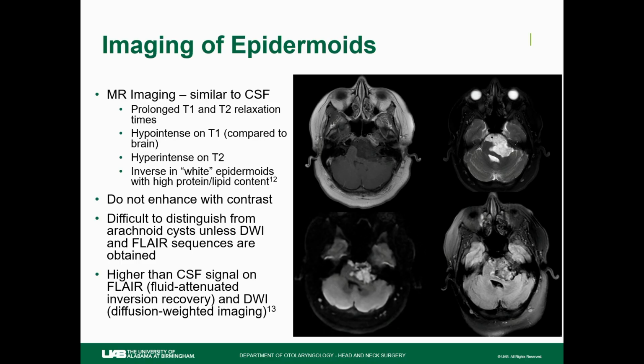They typically do not enhance with contrast. As a result, they can be difficult to distinguish from arachnoid cysts intracranially unless DWI and FLAIR sequences are obtained. On those sequences, they will have a higher than CSF signal.